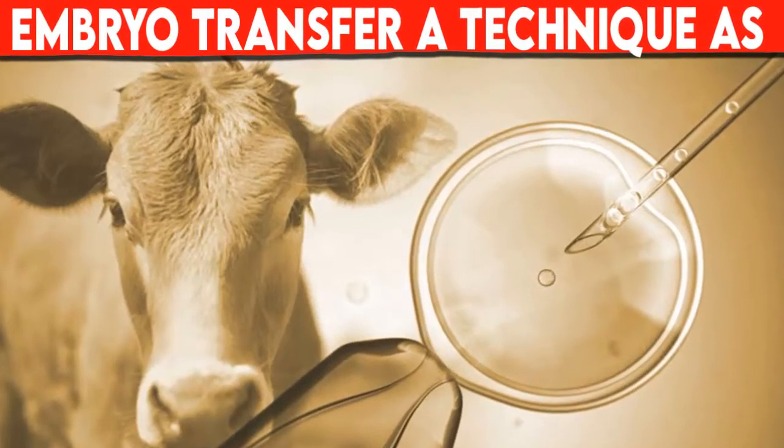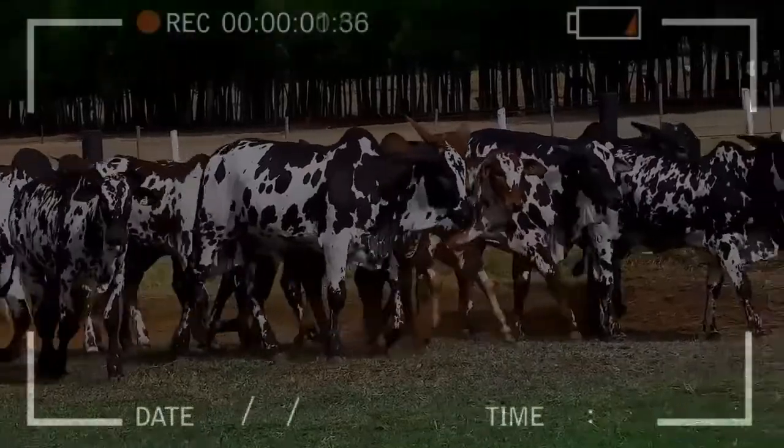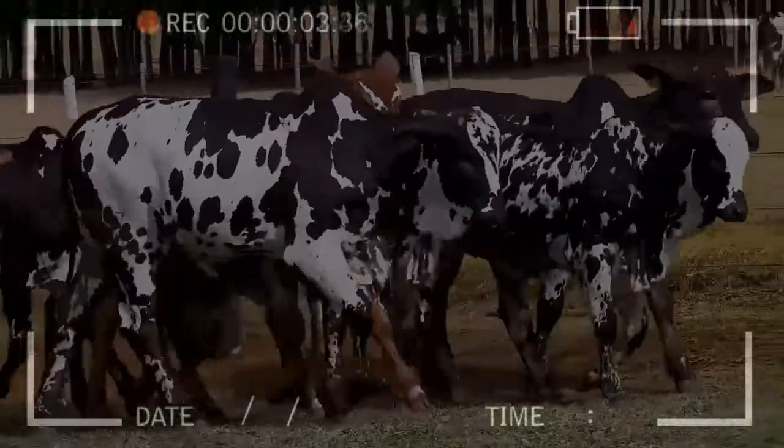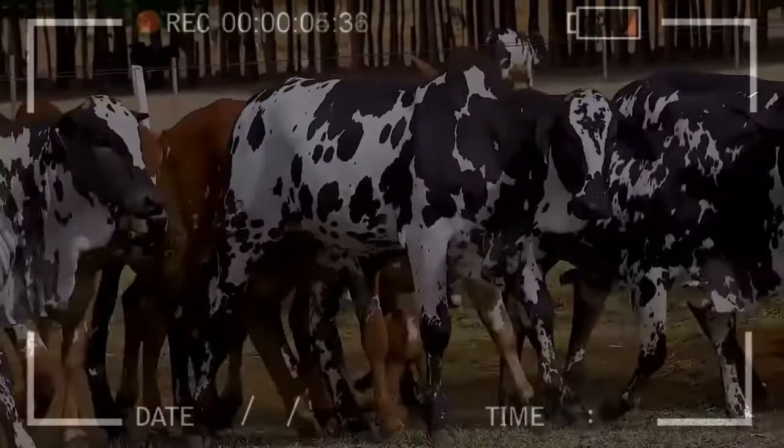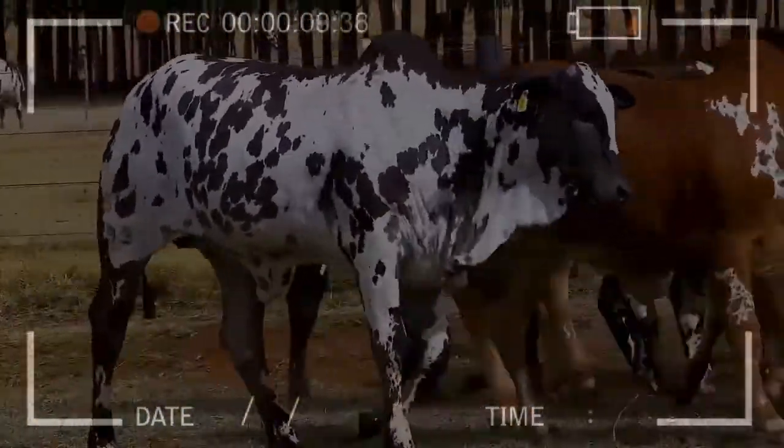Embryo transfer, a technique as easy as artificial insemination. In this video you will learn the steps to correctly carry out the transfer of embryos, which is intended to help the livestock producer on the subject of genetic improvement of cattle members of the herd.